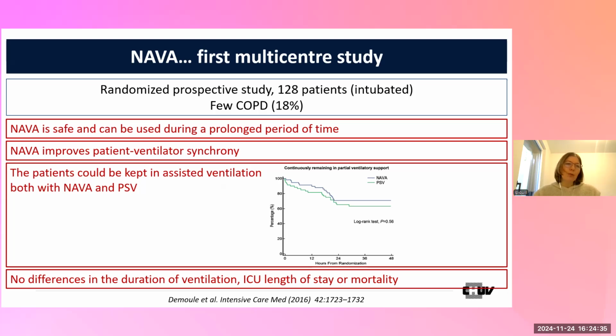And this study showed that the technique is safe, can be used during a prolonged period of time without any problem, and allowed to keep patients under assisted ventilation, as it was also possible, of course, with pressure support ventilation. Overall, this study confirmed that NAVA improved patient-ventilator synchrony. However, there were no differences in the duration of ventilation, ICU length of stay, or mortality. Then overall, on the major outcomes, this was a negative study.